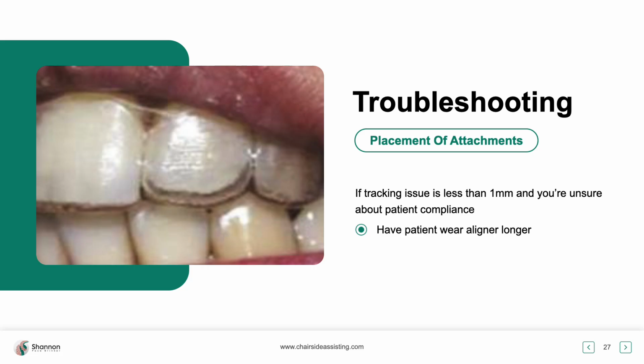The template is sacred. My team knows we never ever cut the template. The only time that I will allow it is if you're new out of the gate. I will allow you to cut it down the midline, so this way you can do one side at a time, but remember, the template is sacred. The other thing is you never give the patient their own template. You never ever do that, okay?